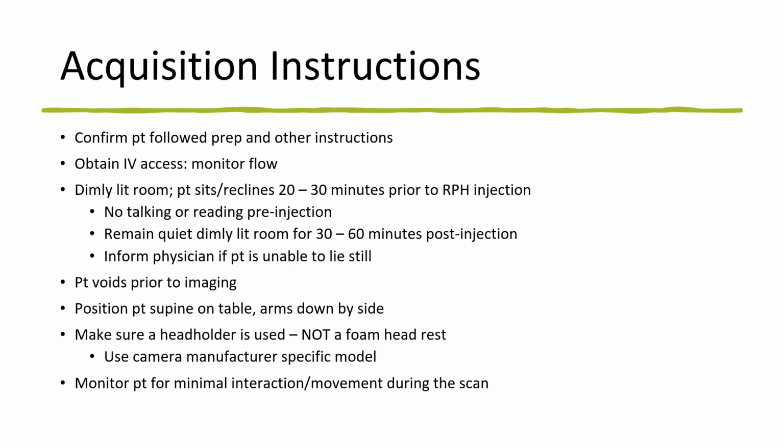It is best practice because it will hold their head in place so they can't move. You don't really want to use a foam headrest, and there are specific head holders that come with camera manufacturers, and you can use those.